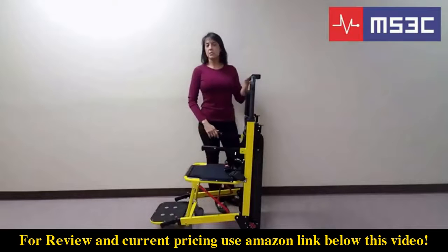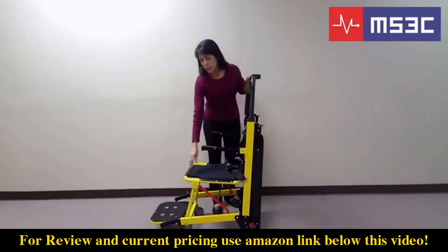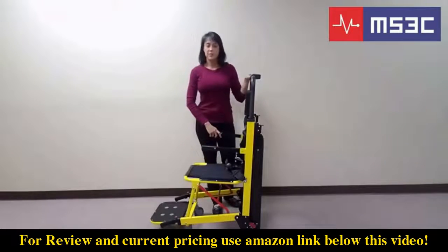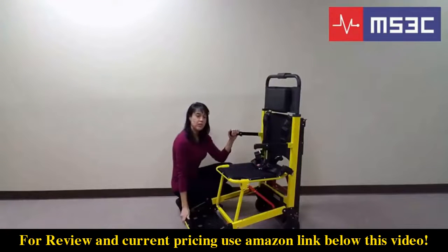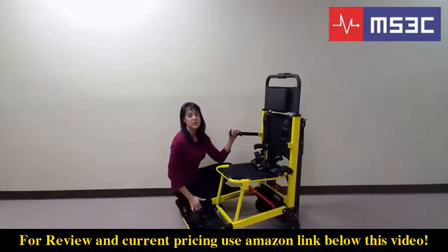The 300 TSB comes standard with both shoulder and lap belts. The neoprene seat cover is removable for easy cleaning. The MS3C-300 TSB comes standard with a solid extended footrest for added passenger support and safety. The lower telescoping handrails are needed when a second operator is available. To extend this handrail, push the red button located at the top of the handrail and slide out. To retract the handrail, push the red button and slide to its original position.